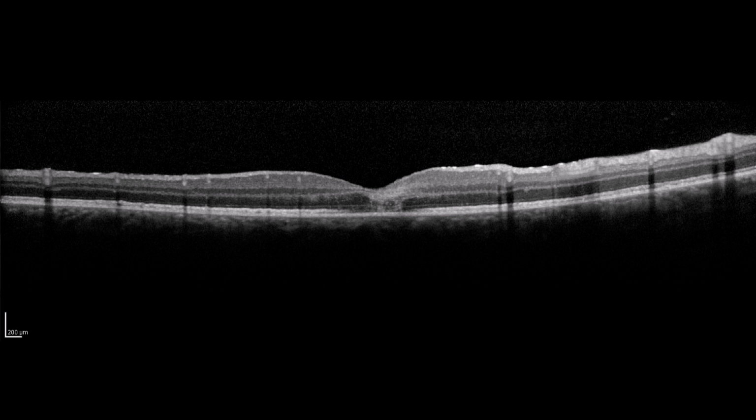Mixed signals, some hyper and hypo combinations. This is a patient who just recently got hit in the eye. This is fresh; I forgot how many days prior they got their injury, but this is a little bit of Berlin edema or commotio right in the fovea. You see hyperreflectivity right there, in the region of the outer nuclear layer and outer plexiform layer, and then some hyporeflectivity in the ellipsoid.